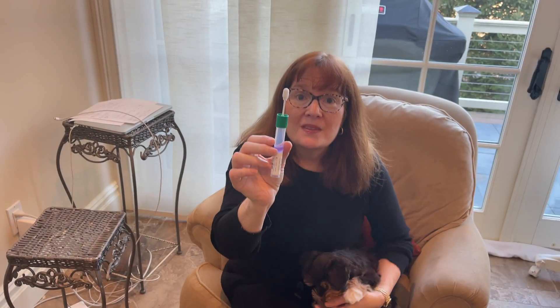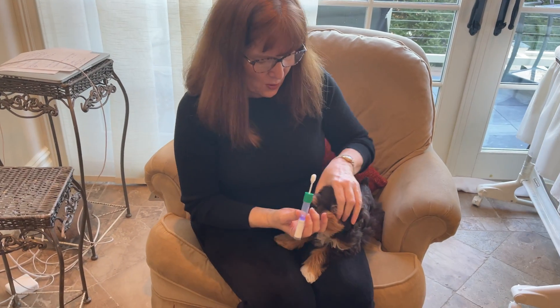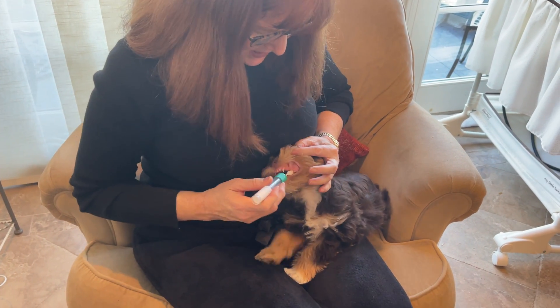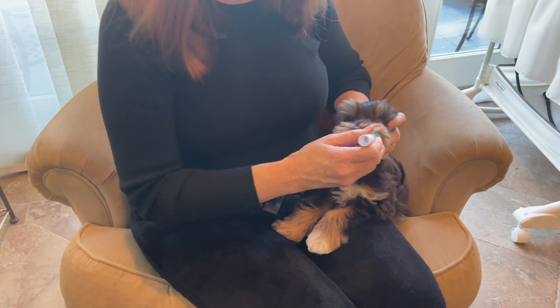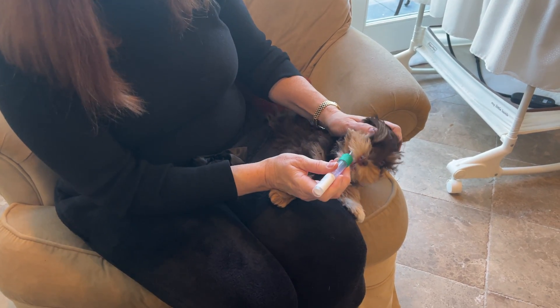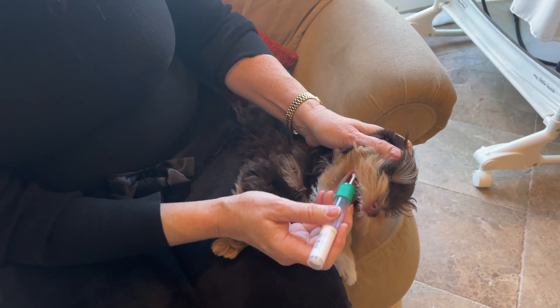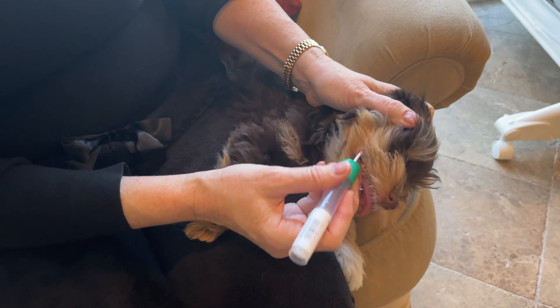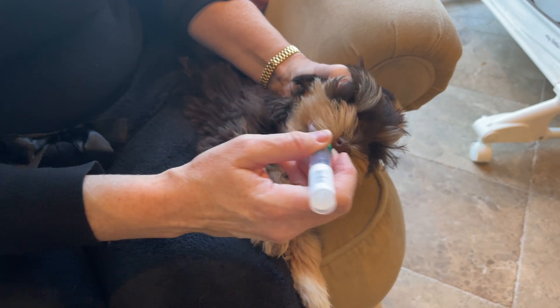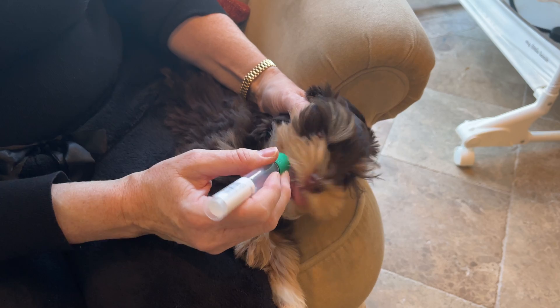Here's the swab, and here's our puppy Truffles that we're going to be doing the swab with today. The challenge with a puppy, of course, is sometimes they start chewing on the swab. I want to get the swab in along the side of the mouth. I'm getting the swab in along the side of his mouth so that we're getting lots of the saliva onto the swab, and I want to do it for at least 30 to 60 seconds. It's okay if I get it on his tongue a little bit.